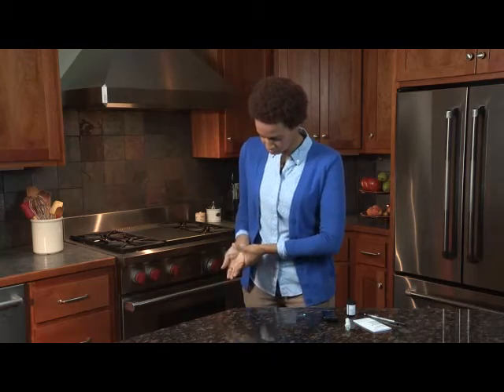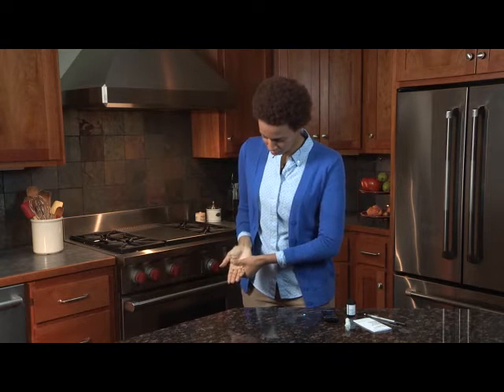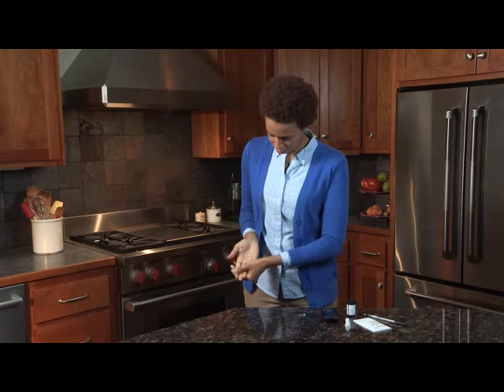Next, hang your arm down at the side for 10 to 15 seconds. Massage through the wrist, palm, and then the finger. This can stimulate the blood flow to the finger more quickly.